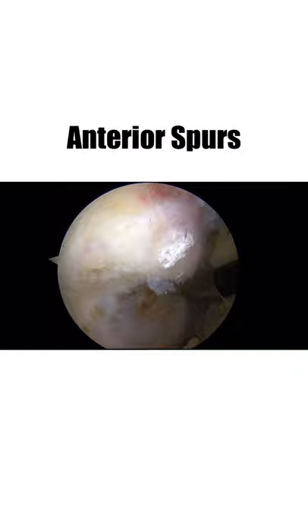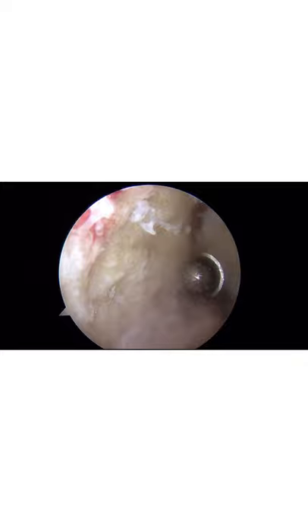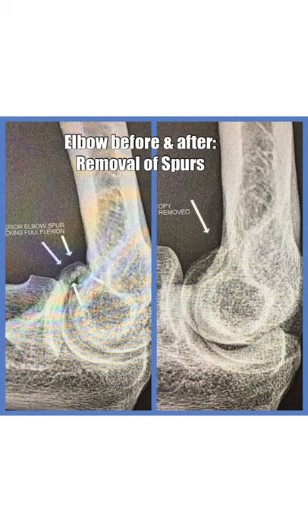Spurs typically cause painful motion, especially anterior spurs, which can cause pain with full flexion. Here I'm showing removal of a spur with a burr, and in this picture, you can see an x-ray which shows a before and after of spur shaving.